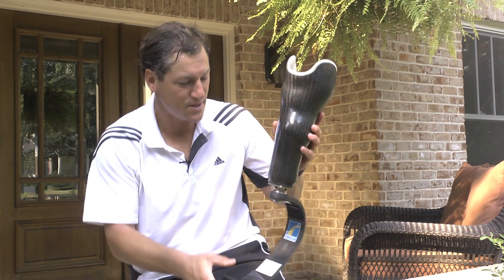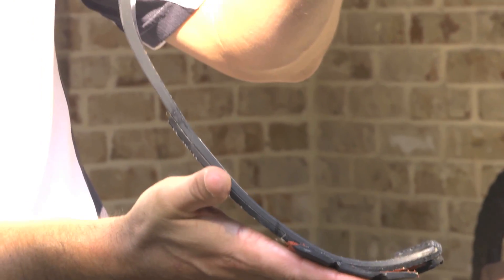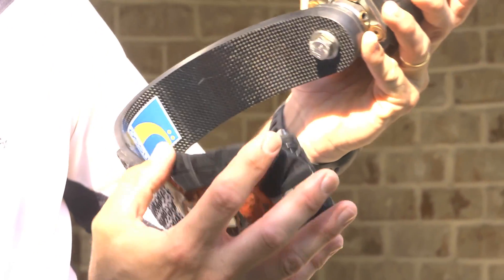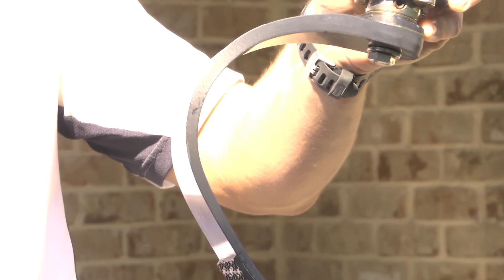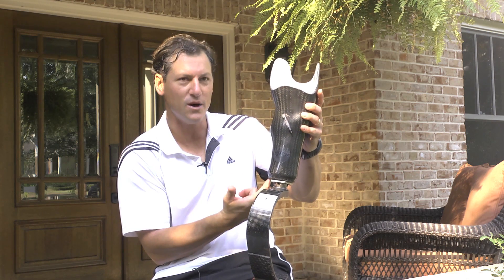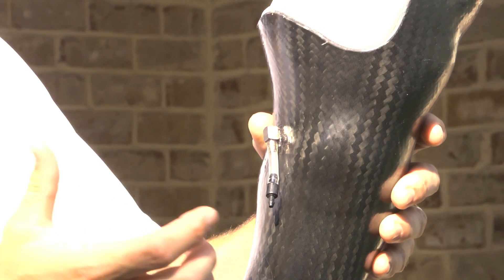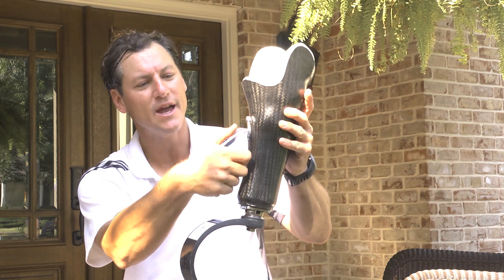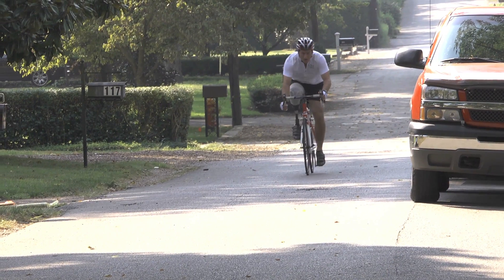Moving on to my running-specific prosthesis — this is a Flex Run by Osur, obviously designed specifically for running. We typically put a running sole or some sort of surface on the toe, and there's no heel, so it's purely made for a running motion. One difference in the socket is we put the suction port external, which allows me to hook to this valve with a handheld vacuum pump and actually pull vacuum suspension into the socket.